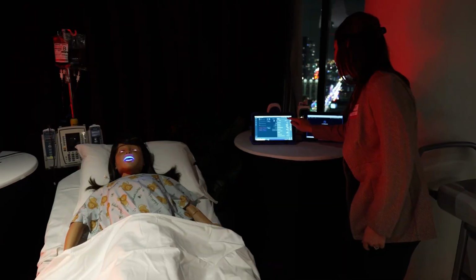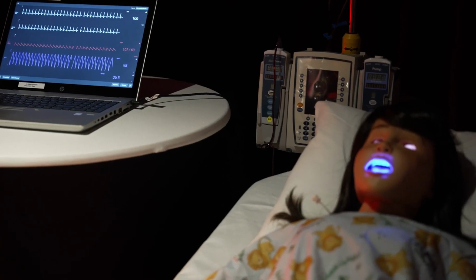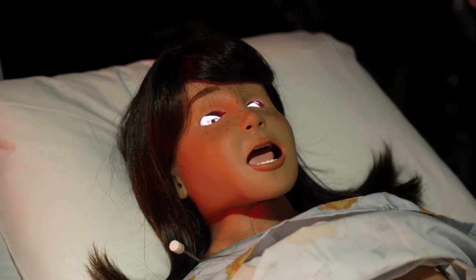We take on that responsibility of educating the next generation of healthcare providers, and we do that through the advantage that we have with all of these technologies. We can immerse them in environments that simulate the hospital setting, where they have patients that they can talk to, they can assess their vitals, they can do complete head to toe assessments, and then we can help regulate all of that in a control room. They walk out with that next level of education that they need in order to care for patient populations that we're seeing in the hospital setting.